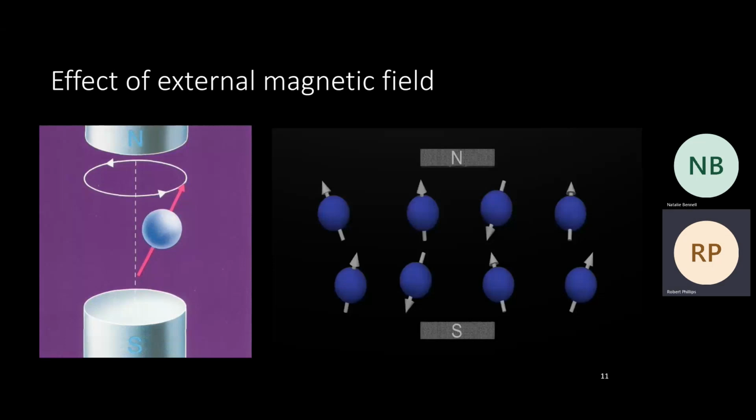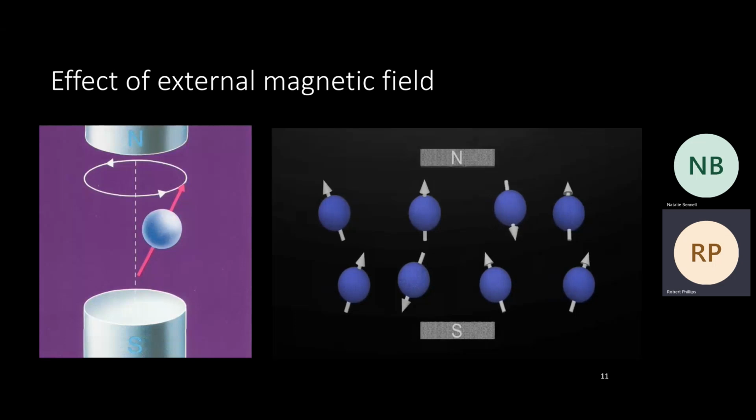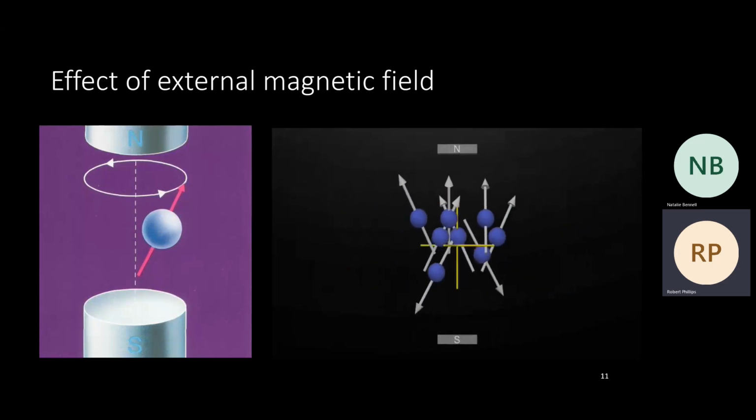But later on, they realized that these protons move chaotically. There is no synchronization there. So they move chaotically, and effectively they cancel out their magnetic force, and the net magnetization becomes 0. Again, nature doesn't want us to be magnetized. So how this occurs, I'll show you in this small demonstration. These are all dipoles of the protons, external magnetic field.